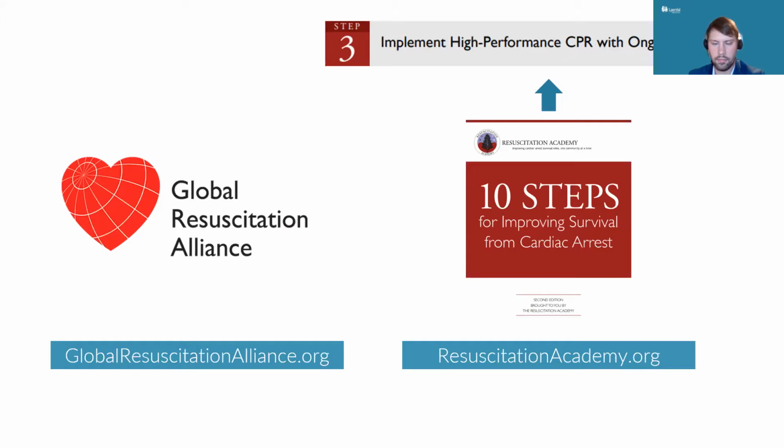So as I put the URLs of these organizations on the screen, I did that because those are really great places to start if you're looking for more information on how you could implement high performance CPR. So within both of these websites, you can find case studies, videos, toolkits, really things that can help you learn more about the topic and potentially help with your local implementation.